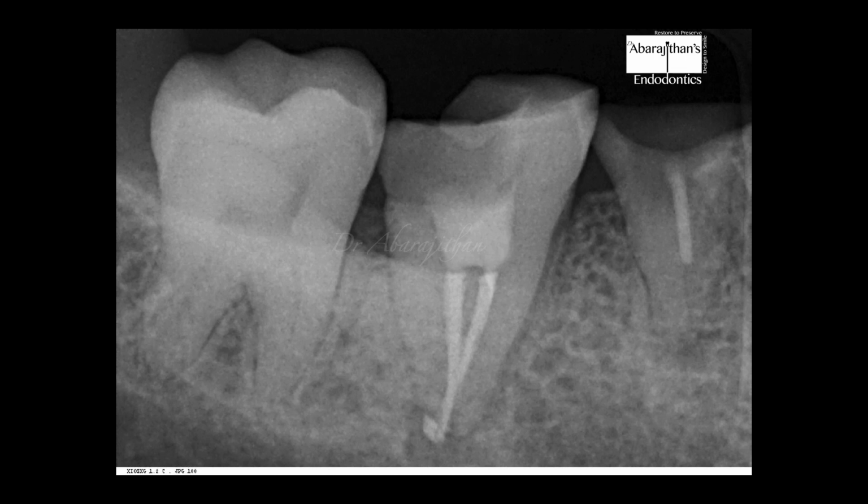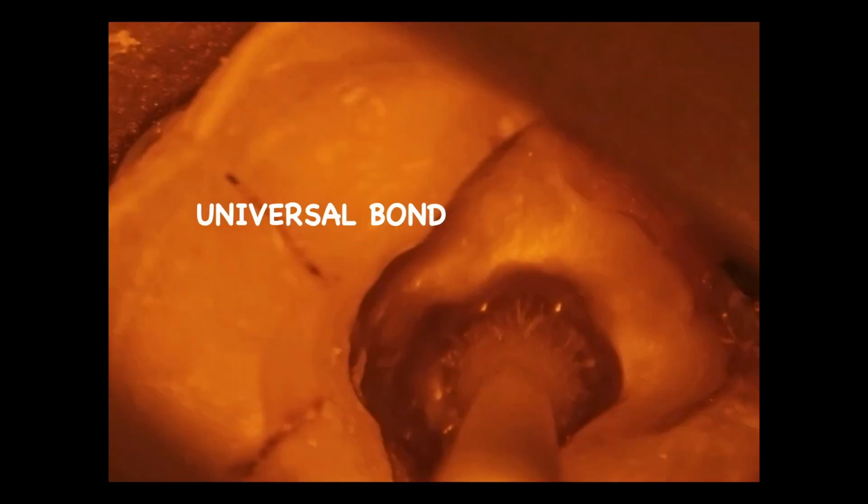So after I finish my endo, I do the orifice sealing immediately. In this case, since it's a referred case, I'm not going to do the final restoration. Even if I'm going to do a restoration finally or not, that doesn't matter. I do the orifice sealing immediately on the same visit. So this is the protocol.